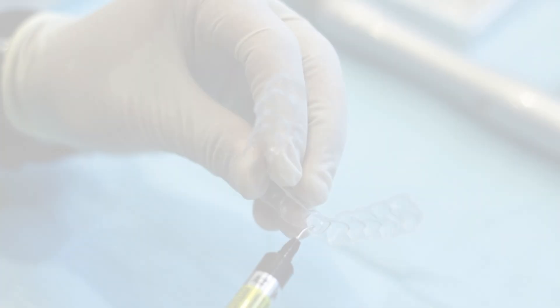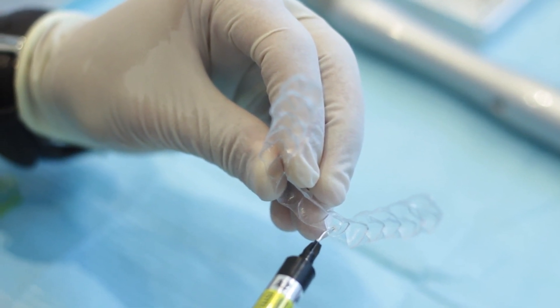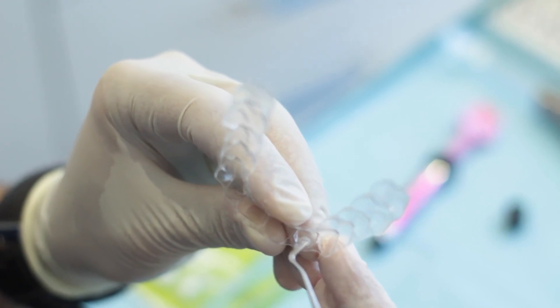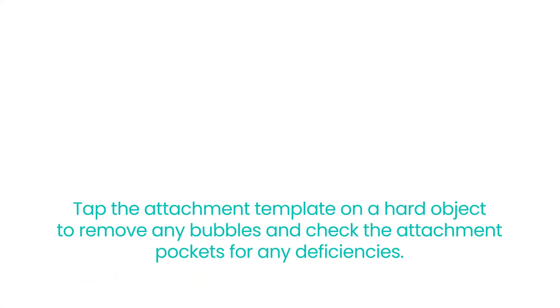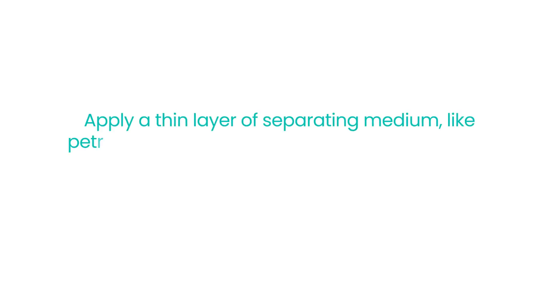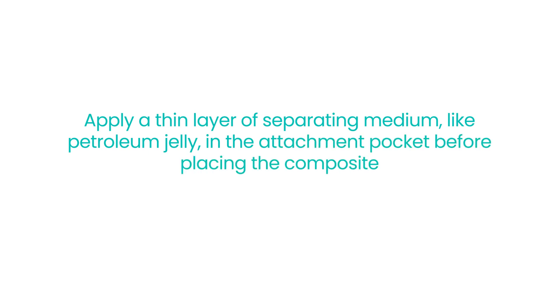Now, it's time to fill the attachment template with composite material. You can use either conventional restorative composite or flowable composite. Start by carefully filling the attachment template, making sure not to overfill or underfill it. Tap the attachment template on a hard object to remove bubbles and check the attachment pockets for deficiencies. A helpful tip is to apply a thin layer of separating medium like petroleum jelly in the attachment pocket before placing the composite, as this makes it easier to remove the tray later on.